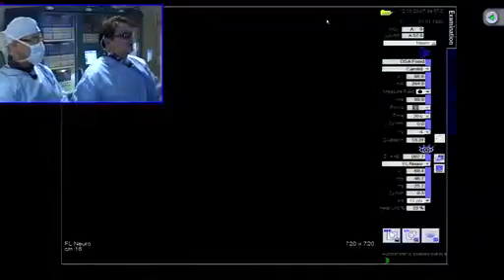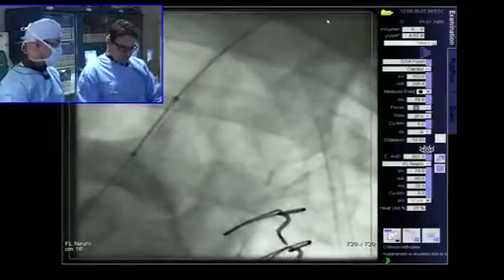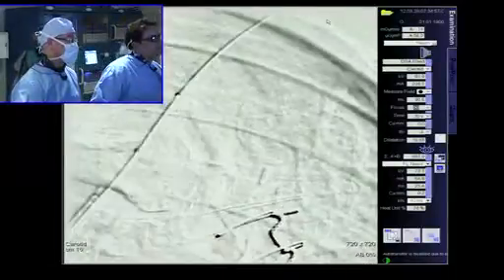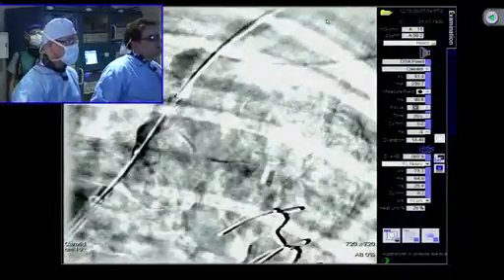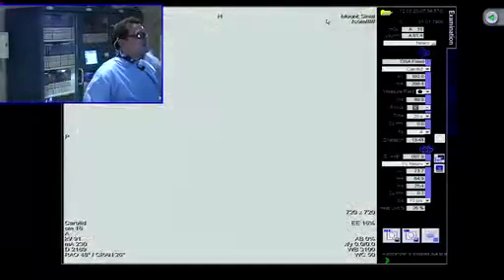They did not project well on our normal screen. So I'm going to have her take a deep breath again. Senora, una vez. Respira profundo. No respire, no respire. Fortunately, she's still breathing. Every time she breathes, the guide goes a little bit away also.